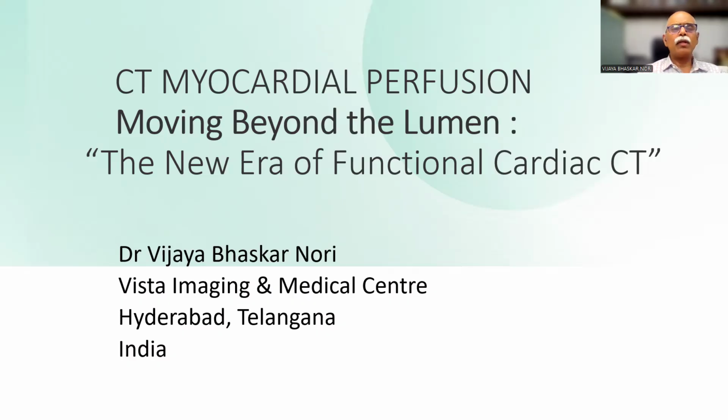Today, I would be bringing you my experience on CT myocardial perfusion, which is one of the latest tools in the armamentarium of CT coronary angiography. We have to understand that the imaging of coronary artery disease is moving beyond the lumen. The new era of functional cardiac CT has started. The imaging of ischemia is now playing a paramount role.